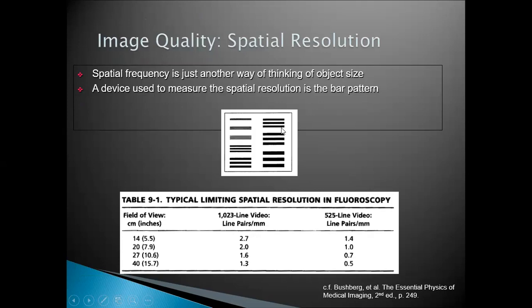We have this bar resolution pattern that is used to measure spatial resolution. As we increase the diameter of the field of view, I mean the diameter of the image intensifier, the line pairs per millimeter required reduces. For this small one, the spatial frequency is very, very high.